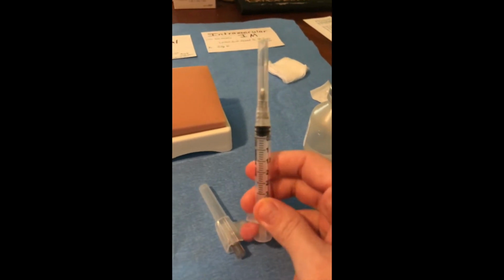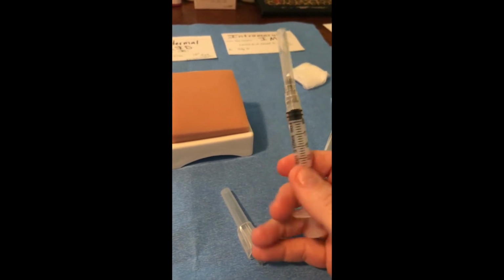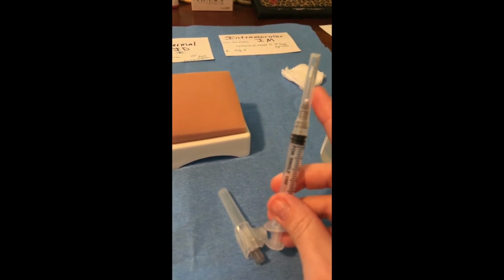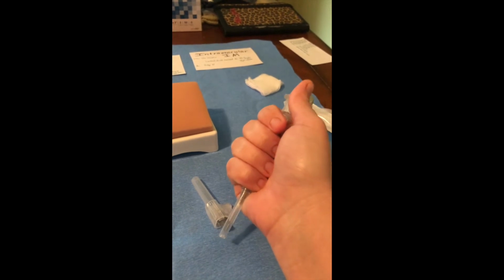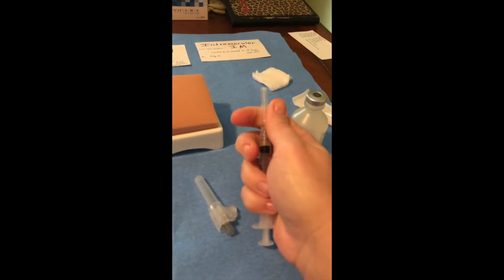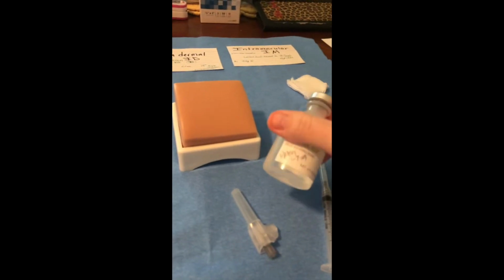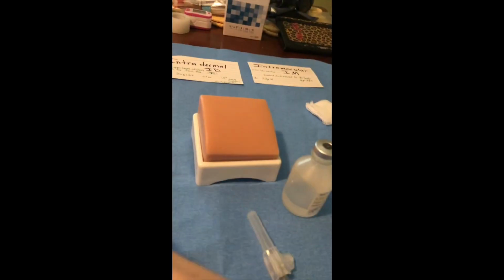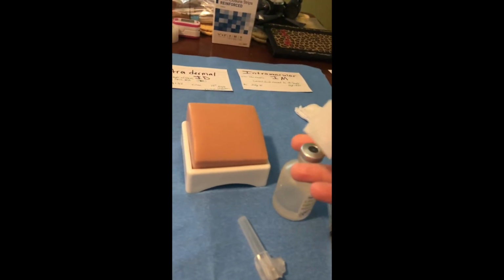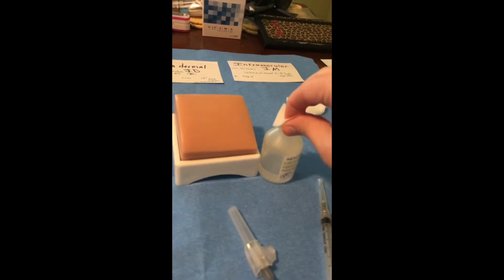So I went ahead and opened my package. I've got my 3 ml syringe and a 22 gauge needle about 1 inch long, already on this to do the draw up. The very first thing I usually do is pull back on my plunger a little bit to loosen it. I make sure that my needle is tight. I've got my medication that I'm going to use, and I get an alcohol pad. Always, always, always, when you're using a multi-dose vial like this that you get out of the cabinet, you're going to clean the top of it off and let that air dry.